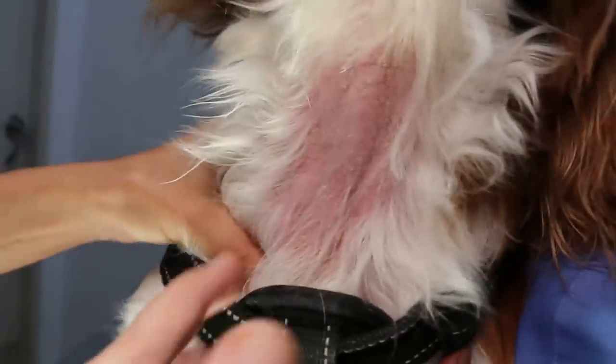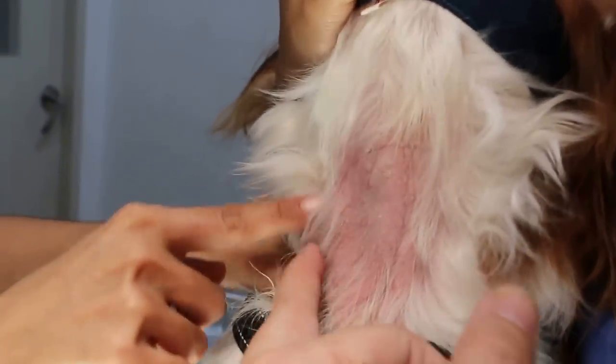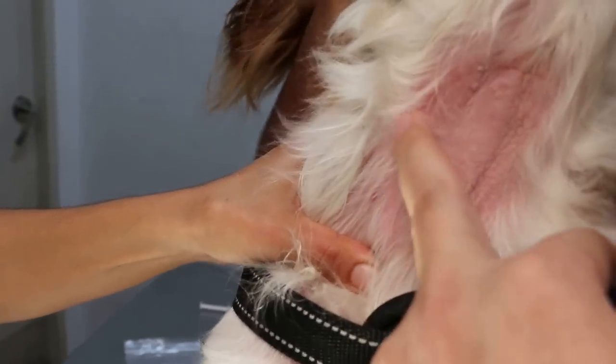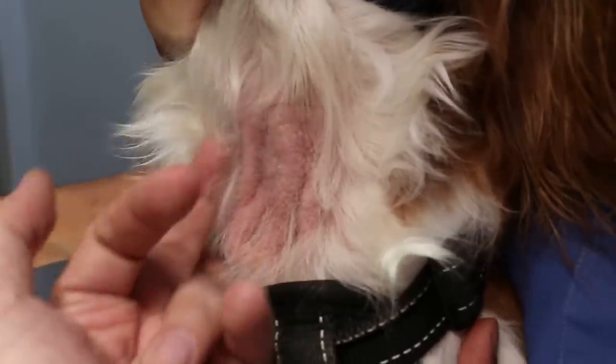She can show when she presses down. The assistant holds her head up, like in the racehorse. Just now I didn't switch on the recording button. So here they can feel the jugular vein — press below and then the needle goes in. Okay, finished. Then we send for lab test.